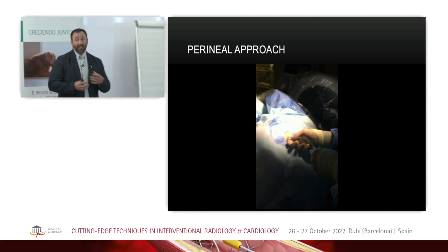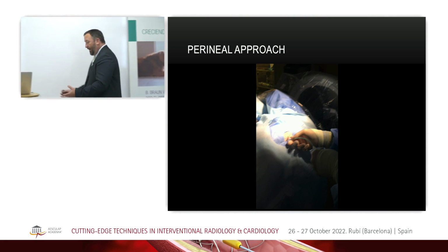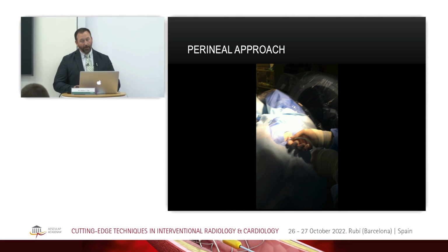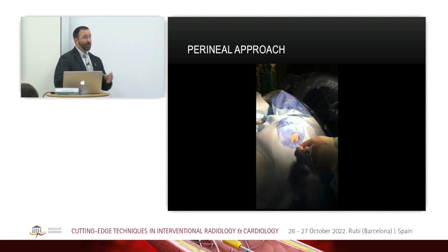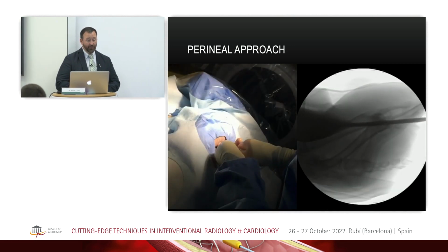You can pass something into it that's bigger than what they normally urinate out of, right? This is a male dog, so you're either passing this to help remove stones potentially, or you're passing this to perform another procedure, and so you're trying to get to the larger portion of the urethra. And so we're passing serial dilators here, and you get it quite large. So we'll dilate this up to 14, 15, 16 French sometimes.